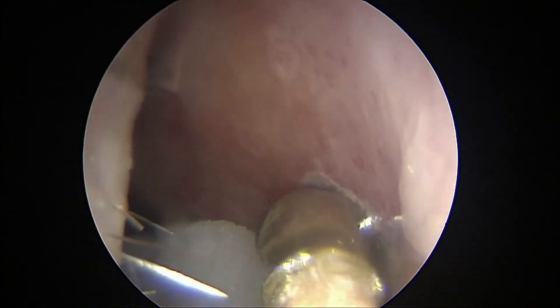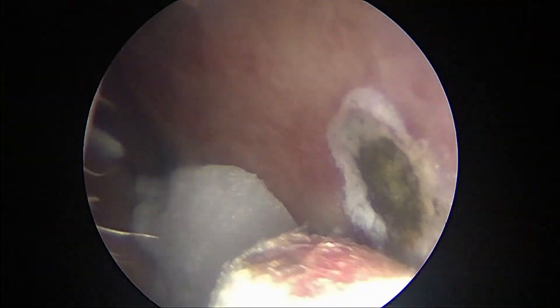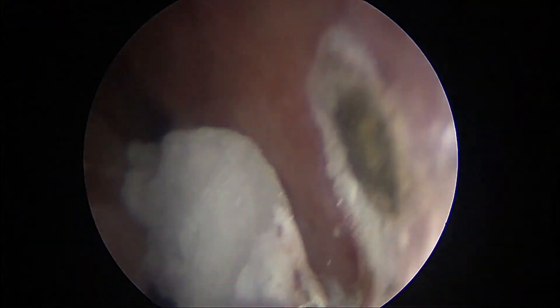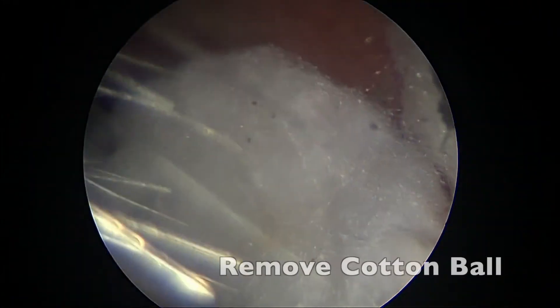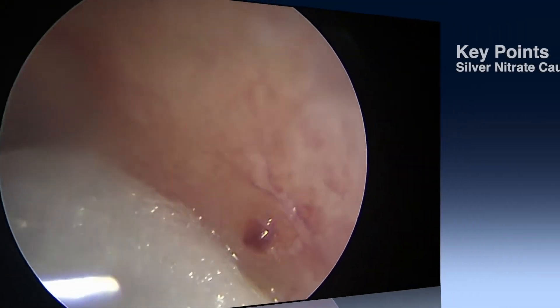Another application. Again, it's just localized. You can get a burn through the septum if you're too liberal with your silver nitrate, so just treat the area that you need. A cotton-tipped applicator again — also wipe away the excessive silver nitrate, and then I remove that cotton ball. If it started bleeding excessively, I could put that cotton ball back on easily.